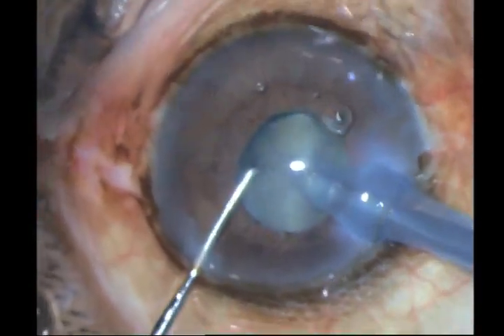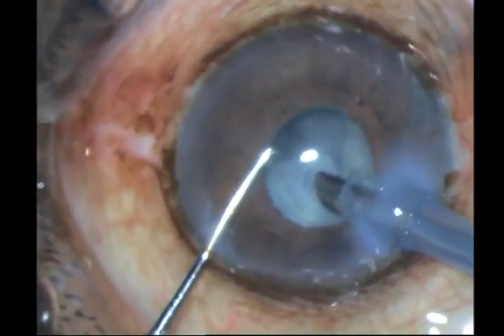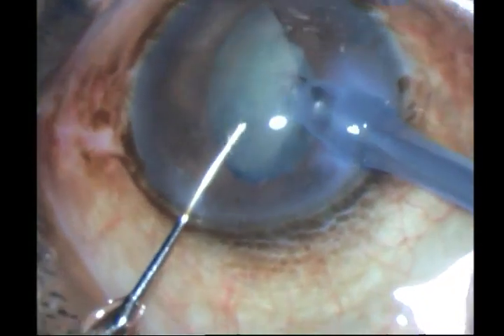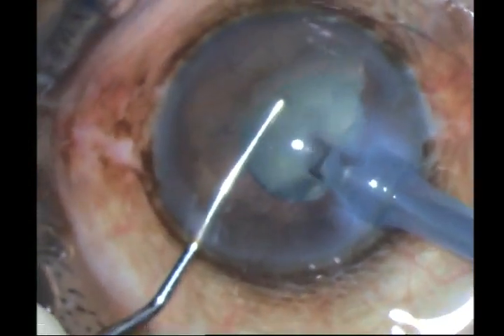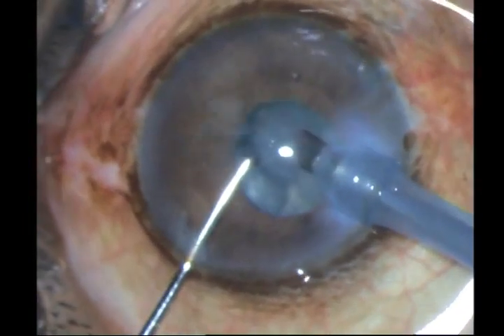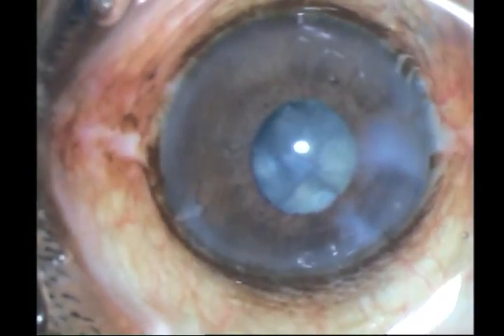Once I have got enough pieces, I slowly take out one piece, and under pulse very carefully with my phaco probe turned sideways, I go ahead and emulsify it at the iris plane or just above. This is a very soft cataract — you don't have to be too worried, but at the same time don't be too confident either. Do it carefully, and once I find it difficult to access the other fragments, I come out.